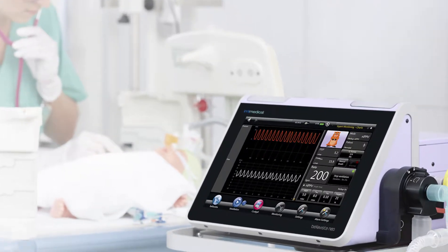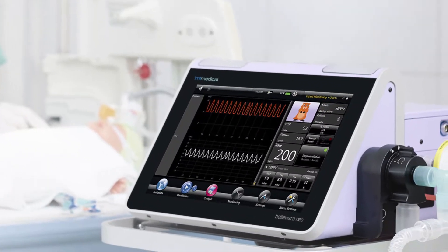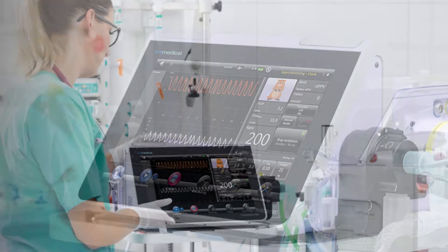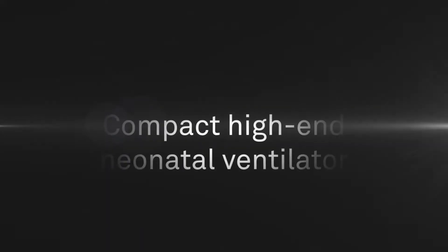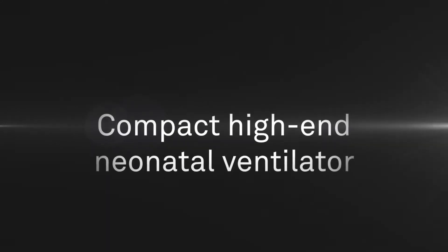Reliability and safety are key in ventilation. BellaVista combines latest technology with precise delivery of flow.